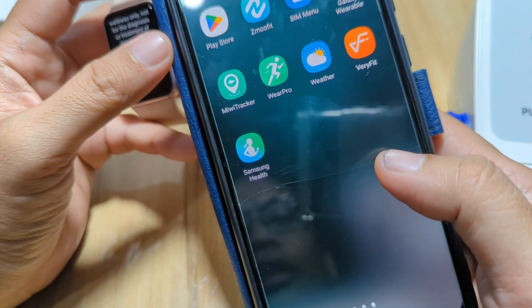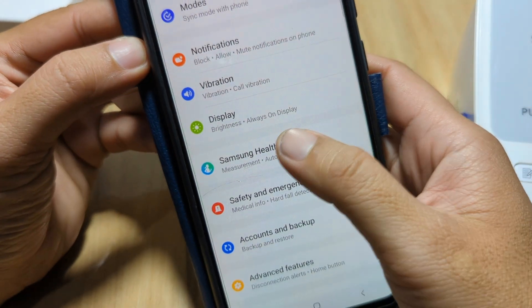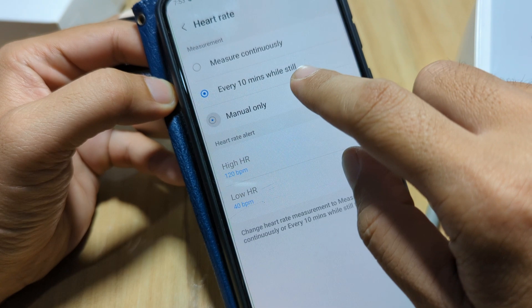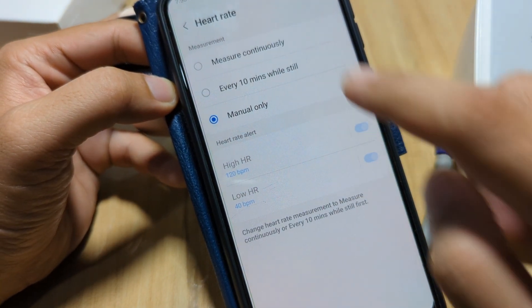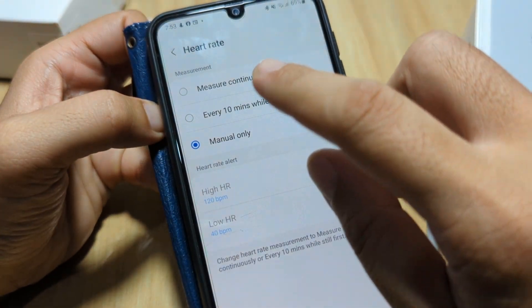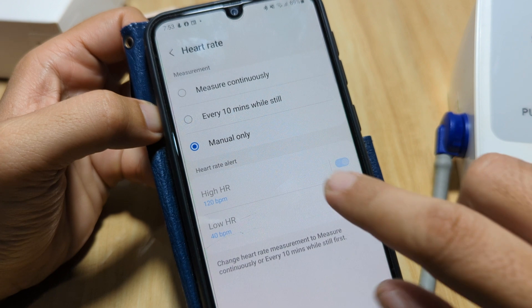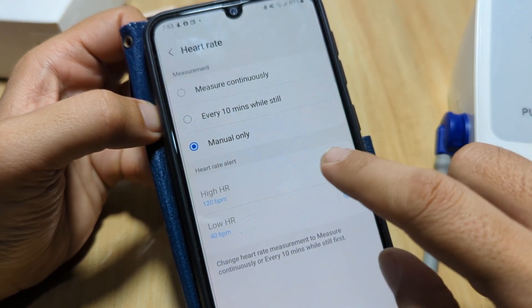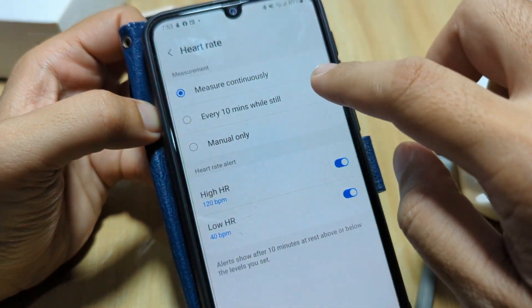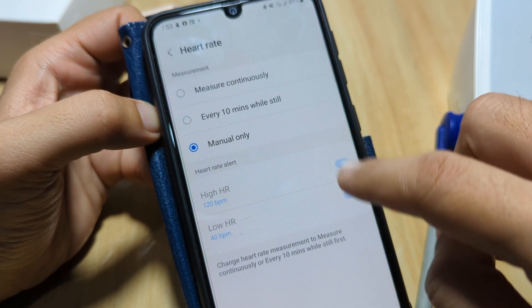Regarding the settings for the heart rate, you can also set it here on the Galaxy Wearable app under Samsung Health > Heart Rate. You can measure continuously every 10 minutes while still, or set it to manual only. Continuous monitoring will make your device deplete the battery much faster, so I set it to manual only. You can also set the high and low heart rate alerts here.